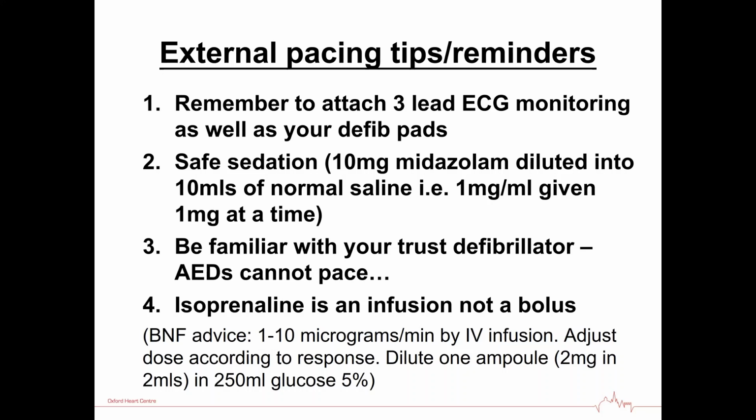And those 2 terms I mentioned, electrical capture is the minimum electrical energy required to depolarize the heart muscle. And although you may see spikes, that may not be actually causing the whole heart to contract. So you always have to check when you see the pacing spikes that you also have a pulse that matches that rate. And that's called mechanical capture, when you feel the pulse.